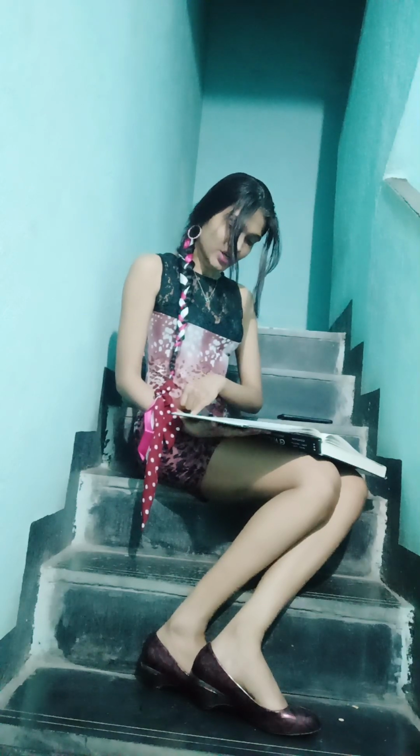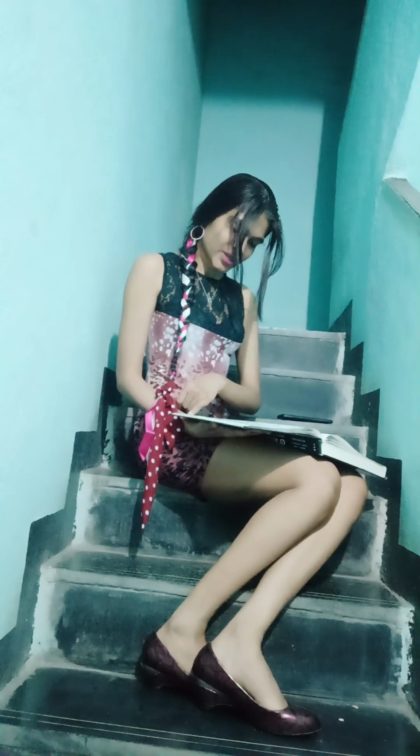Sussman 4 mirror, handheld Zeiss type gonio prism. Thorpe 4 mirror, 4 gonioscopic mirrors inclined at 62 degrees, requires fluid bridge. Ritch trabeculoplasty lens, 4 gonioscopy mirrors, 2 inclined at 59 degrees and 2 at 62 degrees with convex lens over 2. Latina trabeculoplasty lens, 1 mirror for trabeculoplasty.